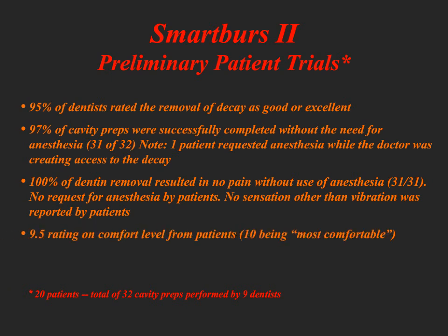A 9.5 rating on the comfort level, that's pretty good. I never tell patients that they won't feel a thing. I tell them, you know what, you may feel a little bit of coldness, you may feel a brief sensation, but it's not going to hurt. If it hurts, we can always do our backup procedure. And every time that I do this for a patient afterwards, even if they had 1 second of, oh, I felt a little something, I'll ask them, would you have rather had an anesthesia? Would you rather had a shot for that? Oh, no, it wasn't that bad. Most patients, not only do they not like getting shots, but they don't want to leave the dentist and be numb for hours afterwards.